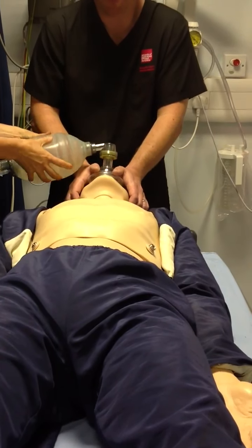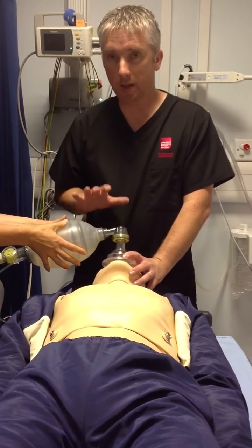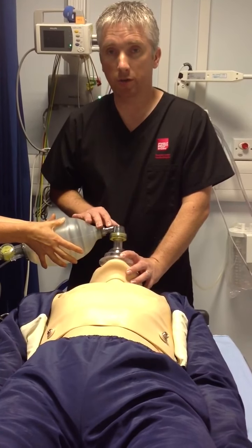These bags can be used without an oxygen supply. But if you're near an oxygen supply, it's a good idea to connect it up and put a 15 litre flow of 100% oxygen through there.